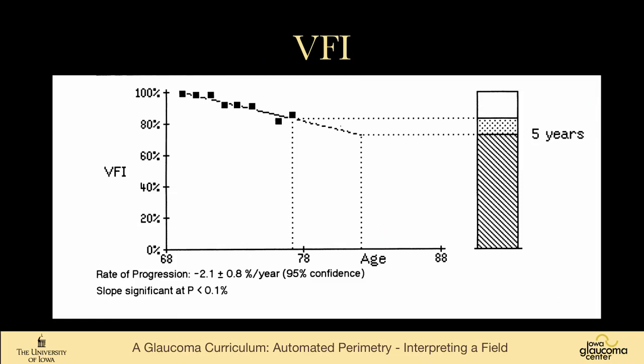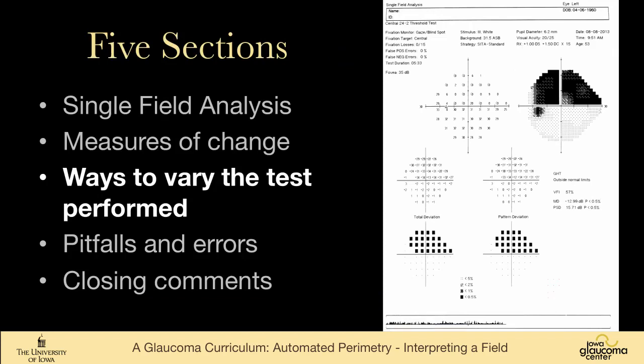And the glaucoma progression analysis will say that this is likely progression in this patient's visual field. You can also look at the visual field index over time. You can see that this is trending down. The rate of progression of minus 2.1 decibel per year, and that's significant with a p-value of less than 0.1%.